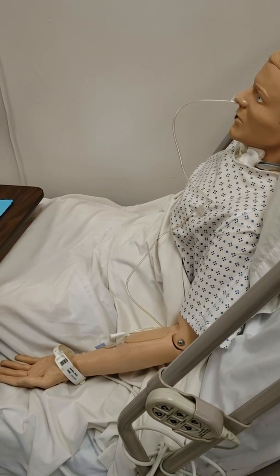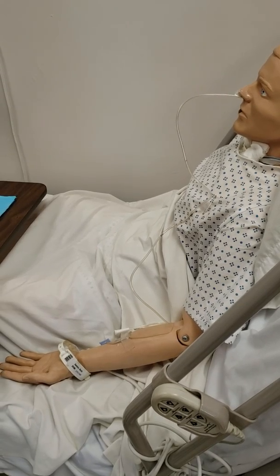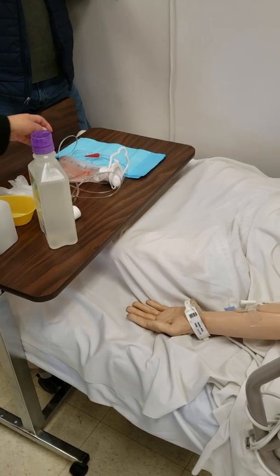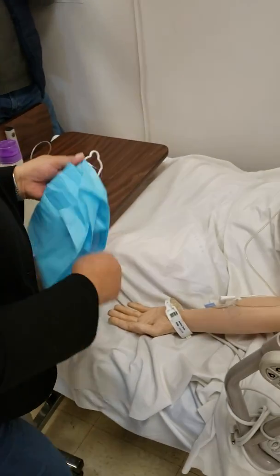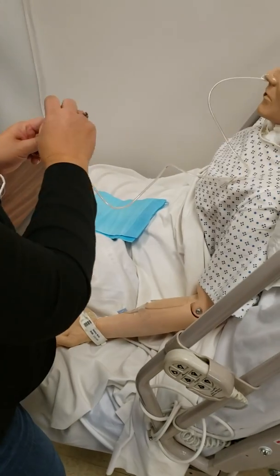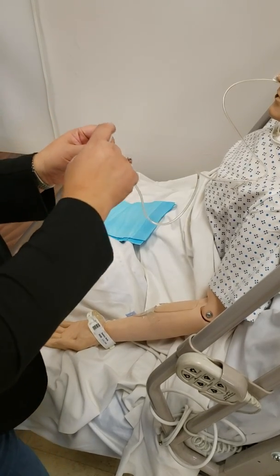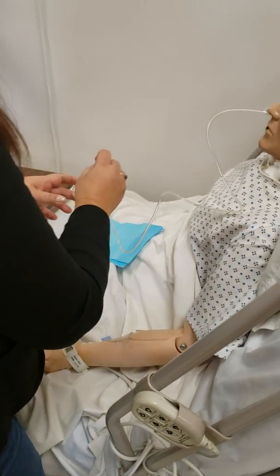Yes. So you will also now wear your gloves. All right. So wear your gloves. Put this chalk over here. This one usually has a little cover, because it's not supposed to be open all the time.